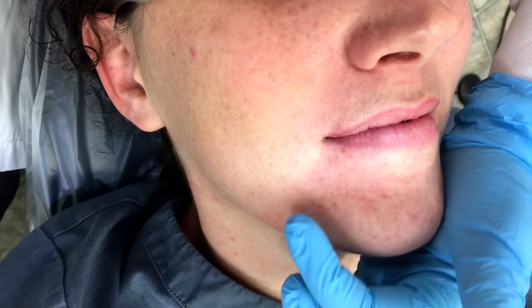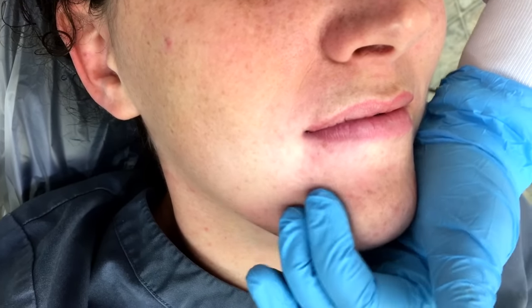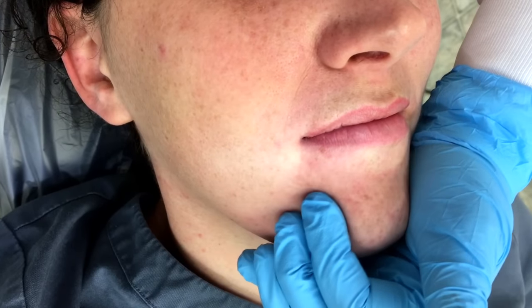I like to tell my patients that they're going to feel like they have a grape in their chin, and I'm going to push on that and massage it into the foramen.